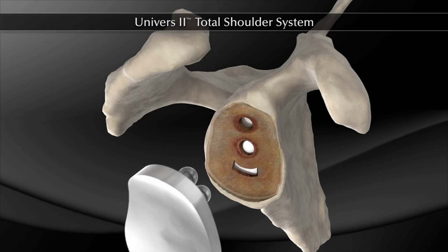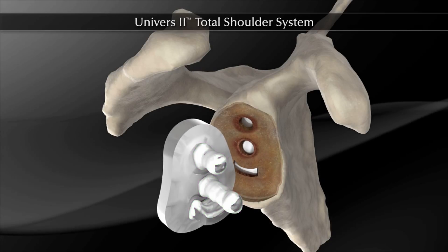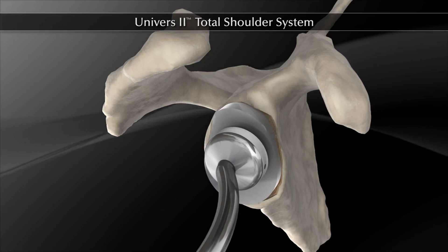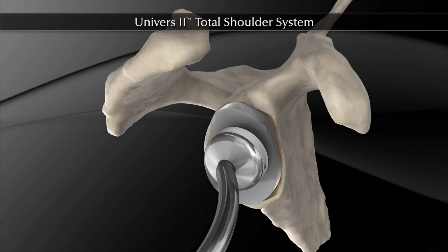The appropriate size glenoid implant is opened and bone cement is pressed into the keel fenestration and around the pegs. The implant is pushed into the cement-filled glenoid vault and impacted. The glenoid component is held firmly in place until the cement has cured.